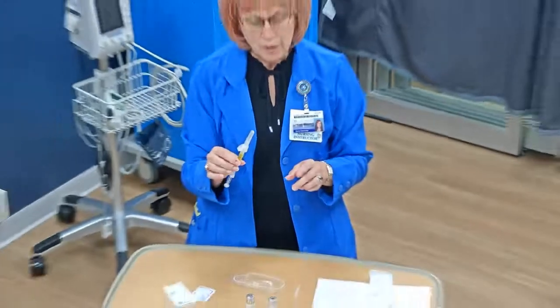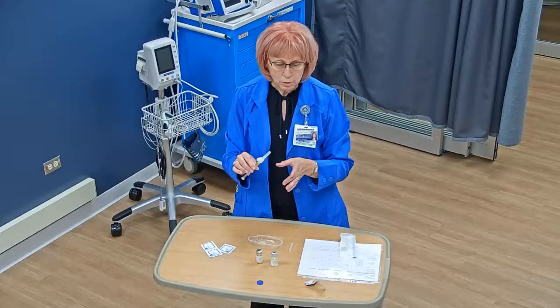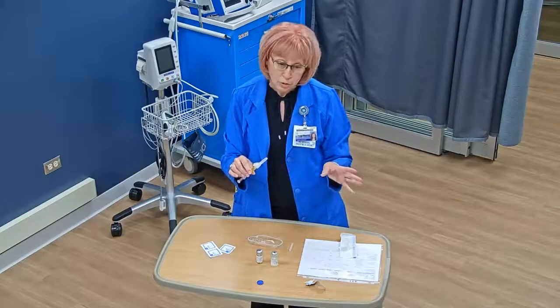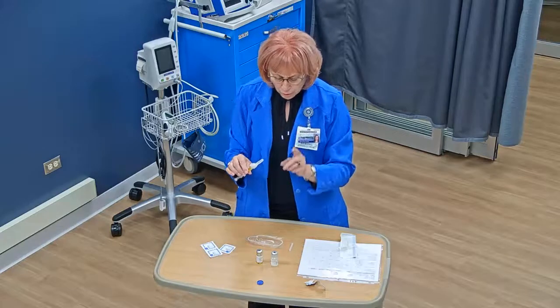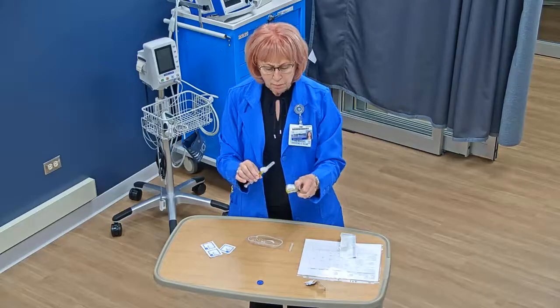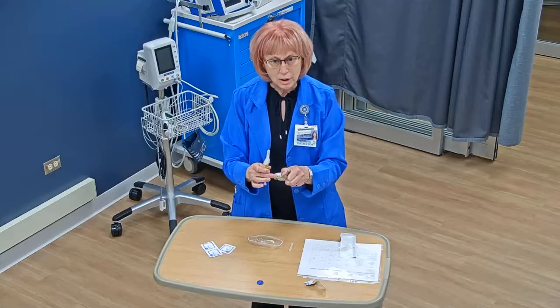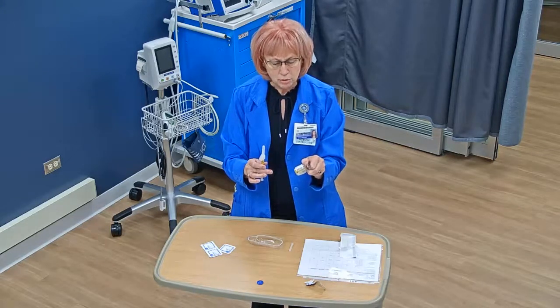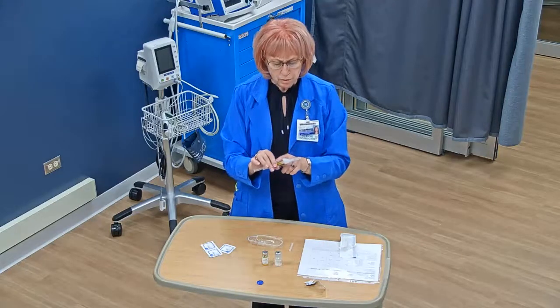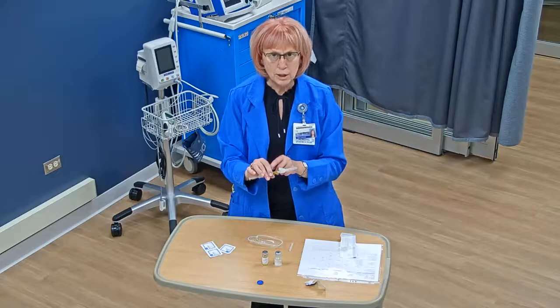When I go down to my patient's room, if I work at a facility where I have to bring the computer with me, I bring the computer. If there's a computer in the room, I don't need to bring it, but I do have to bring the vial and the diluent because the barcodes on both vials are needed. I will need to scan them in order to give the medication to the patient. That is the complete procedure for how to reconstitute a powdered medication in a vial.